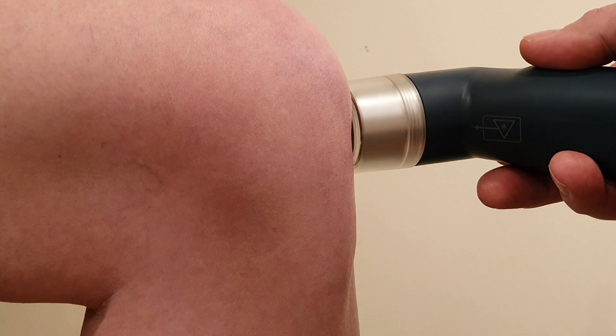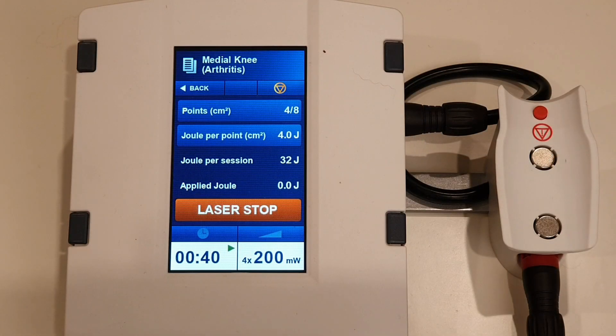It's a good treatment. Applying this treatment to the patient, you'll see that the applied joules is counting up and the amount of time is counting down. This is a very popular treatment to give. That's the first spot done — we'll move to the second spot. Within the literature, most of the articles centre around the joints, and of course the knee being the most popular one.